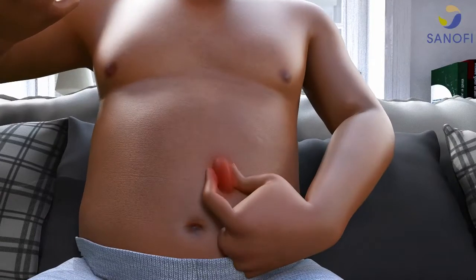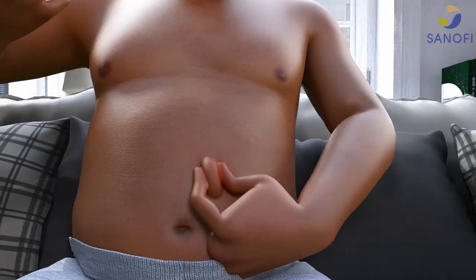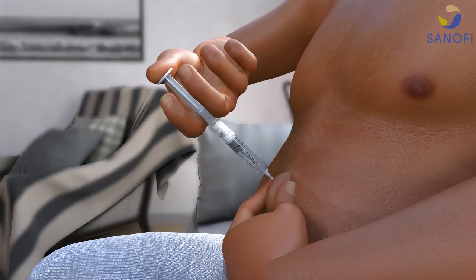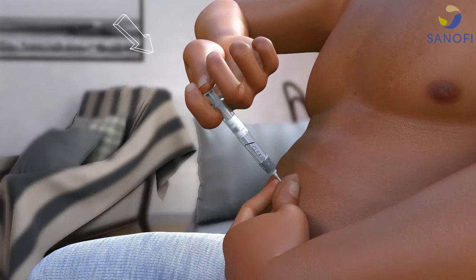Pinch a fold of the skin you're going to inject between the thumb and index finger. Insert the whole length of the needle into the fold of the skin, holding the skin between the thumb and forefinger, the needle straight and at right angles to the body. Press down gently but firmly on the plunger until it stops and the syringe is empty.